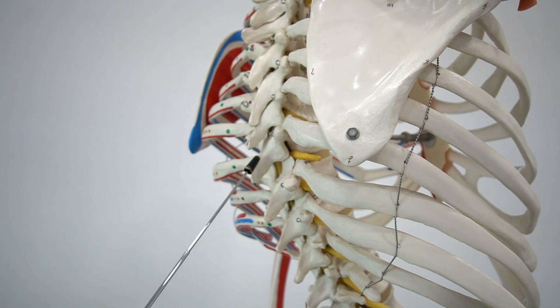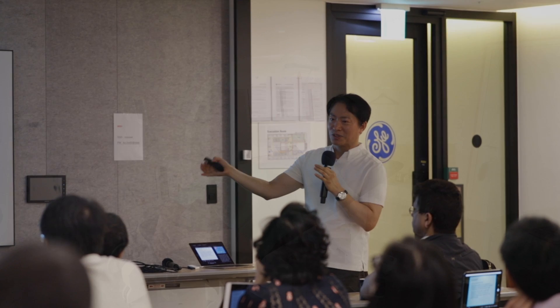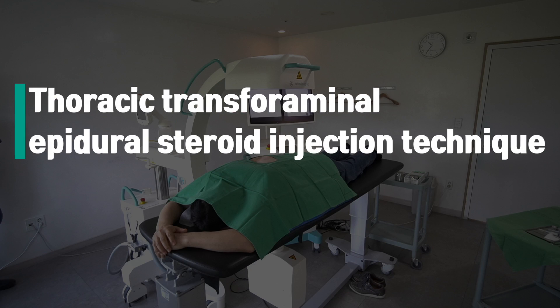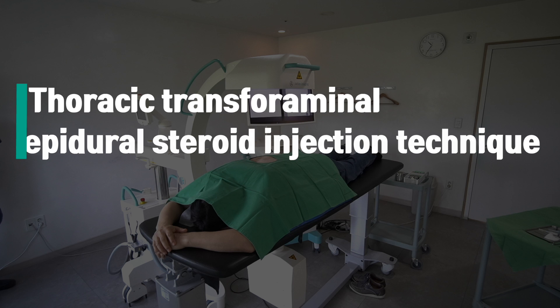The transforaminal approach is the best way. Hello, I'm Dr. Lee. Welcome to Practical Pain Management. Today I'll show you a thoracic transforaminal epidural steroid injection technique. I'll perform it under AP, lateral, and contralateral oblique image guidance.